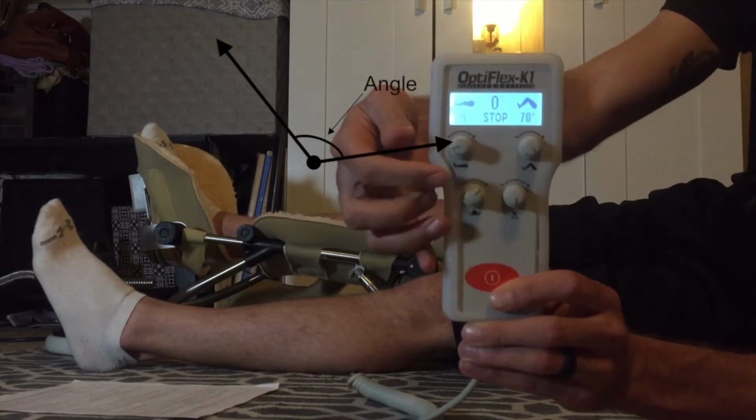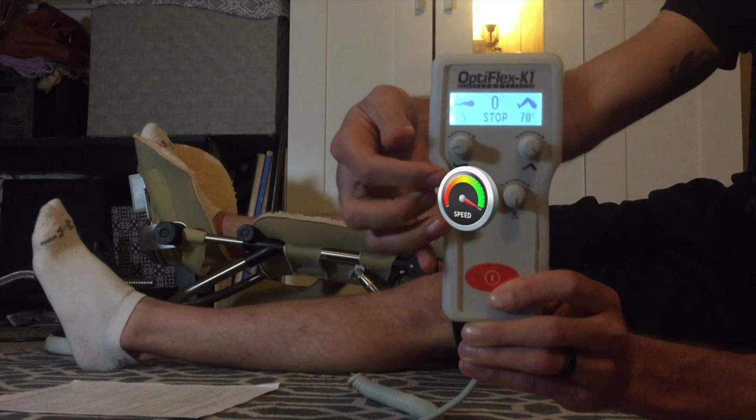So you can go from one angle to another angle, and the range goes from negative 10 degrees to 120 degrees. You also have a speed dial to adjust the speed at which the machine is moving your knee. And then you also have kind of like a hold button or a pause button, and this is how long it's going to hold that angle once it reaches that angle setting.